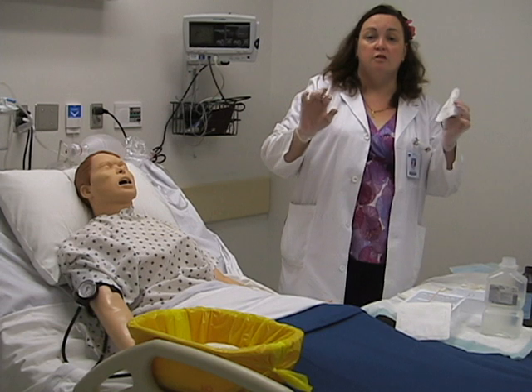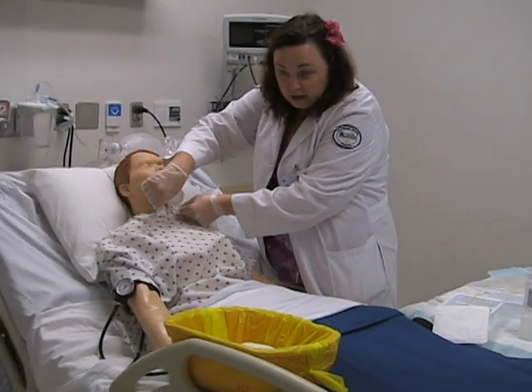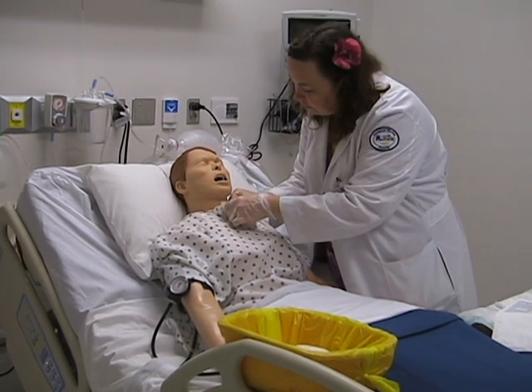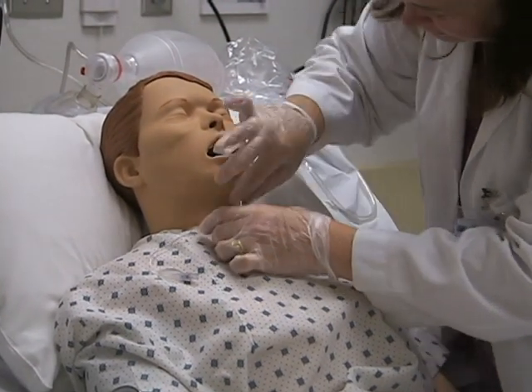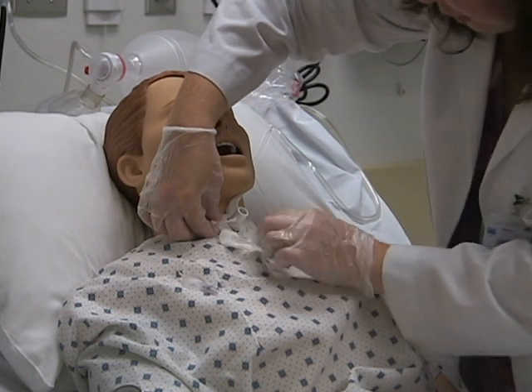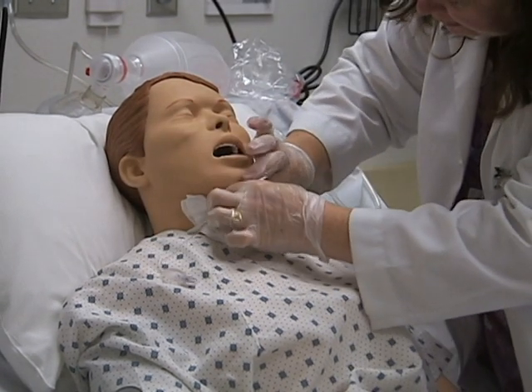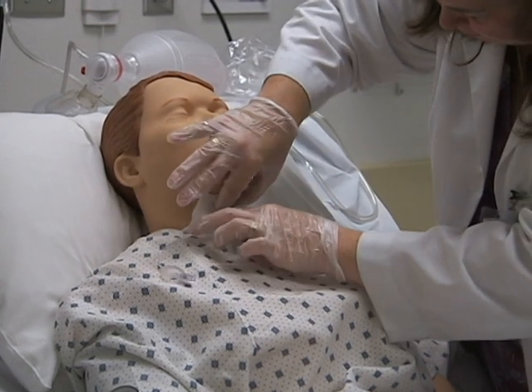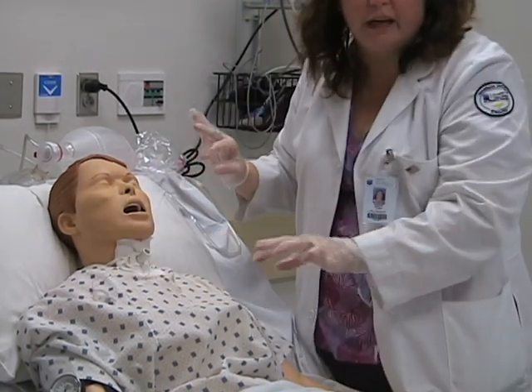We're going to replace the tracheostomy sponge. There's a difference in how you put it — some people put it overhand and under; I put it under and over because it's easier for me as I'm left-handed. When you go to insert it, I like to push up one side at a time. Make sure your balloon valve is not tucked into your trach sponge. Try to make sure there are no wrinkles or creases underneath the face plate, because that will cause skin breakdown.